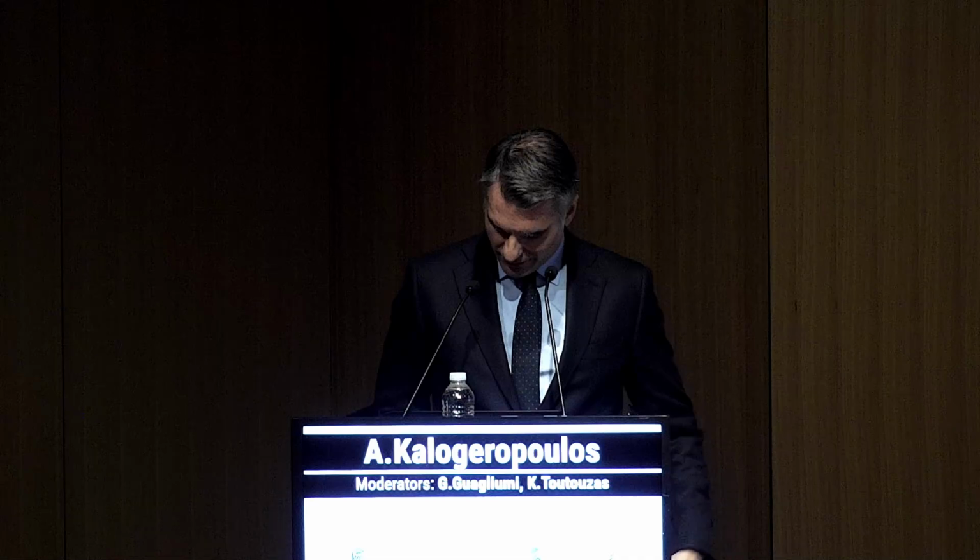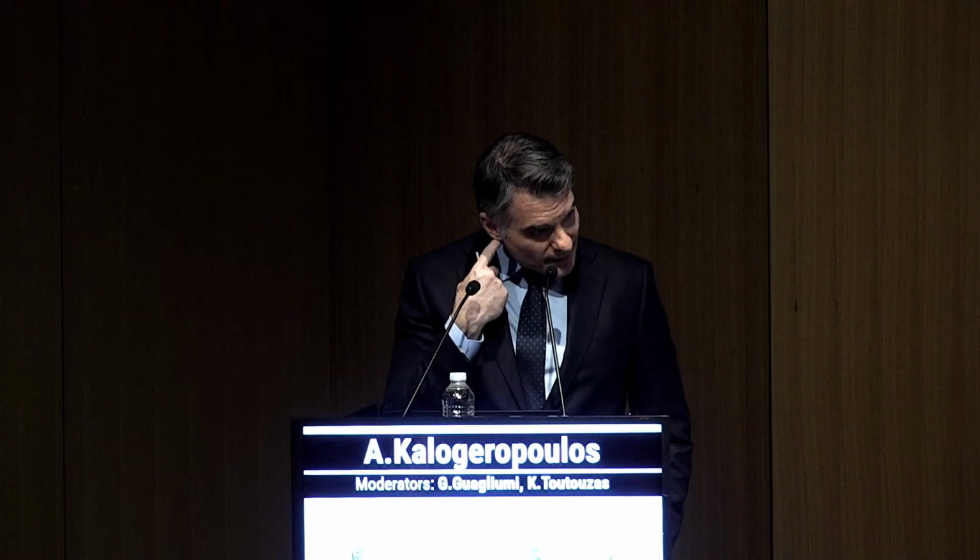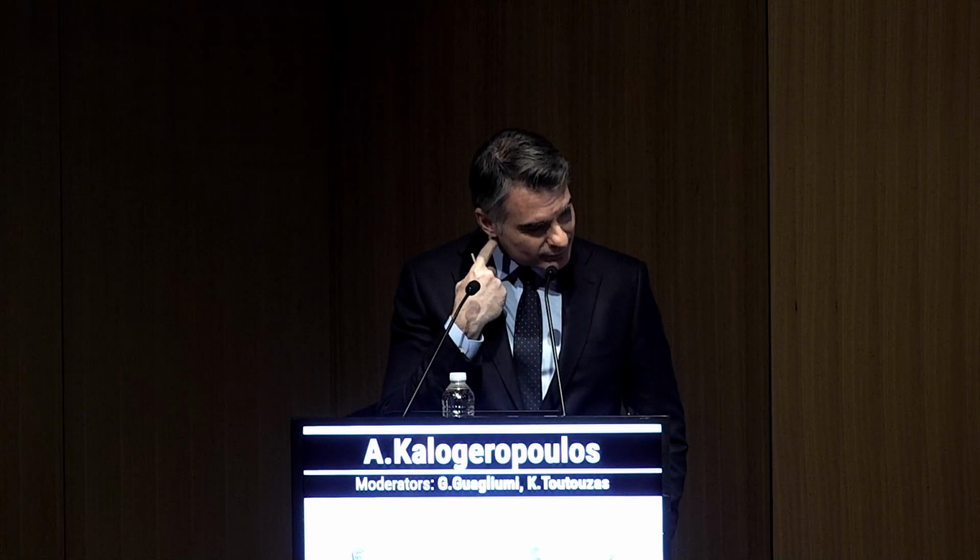High aggressive. Yeah, but we have to agree that it's a very diffuse disease right now. It's not like a spot lesion that we considered from the angio from the beginning. Correct. And we have some information about the plaque burden, from where to where, and the size of the distal reference. So, any comment from the discussant? So now I'm convinced that it's a diffuse disease.